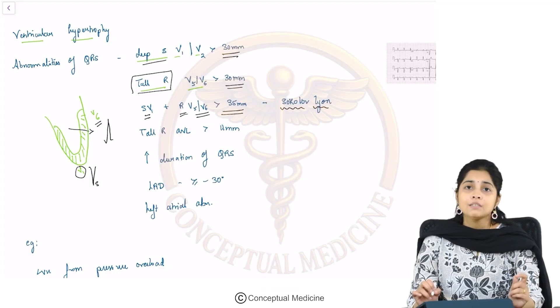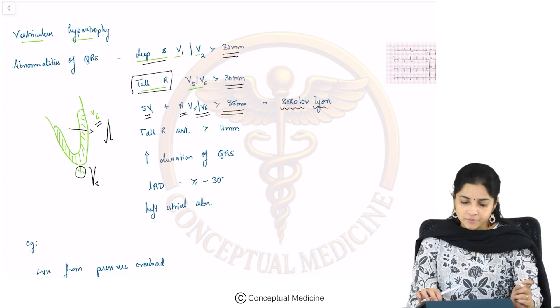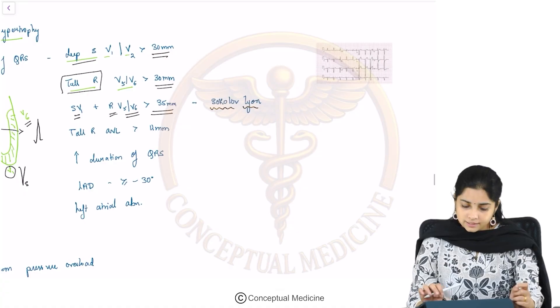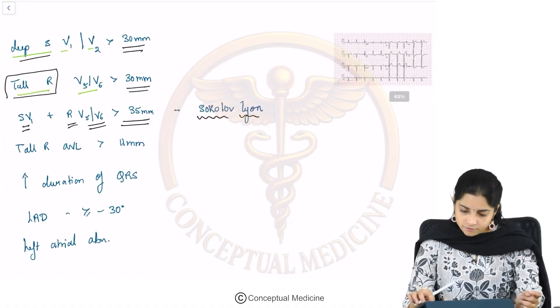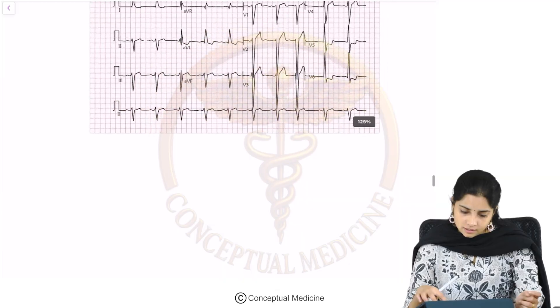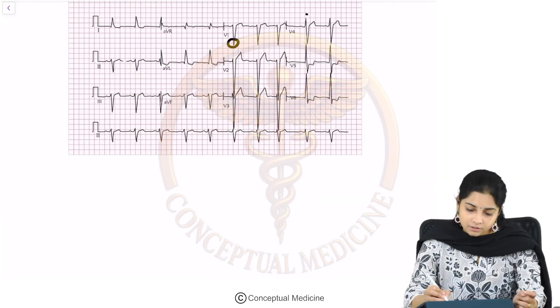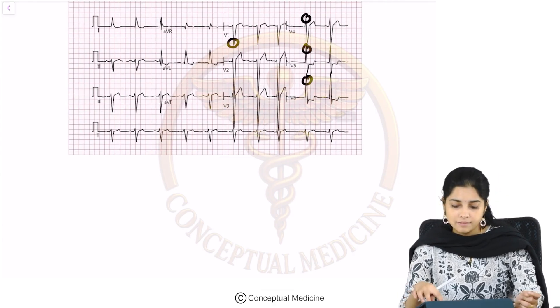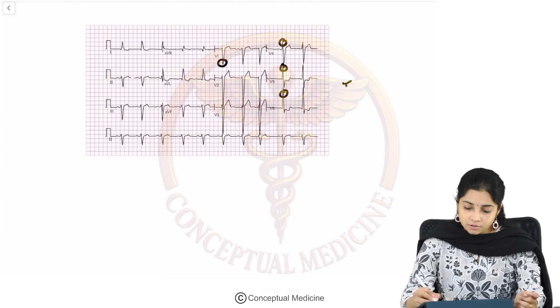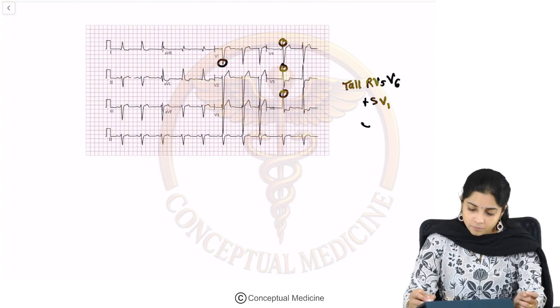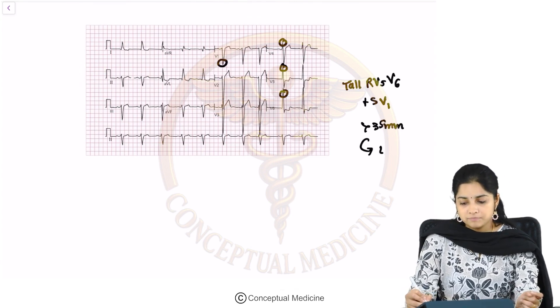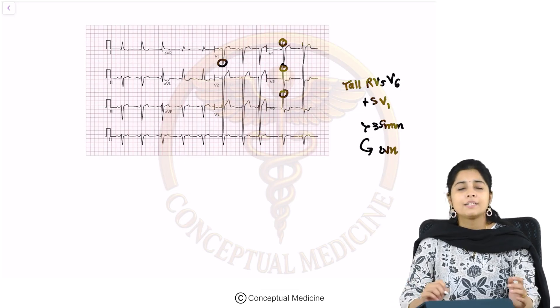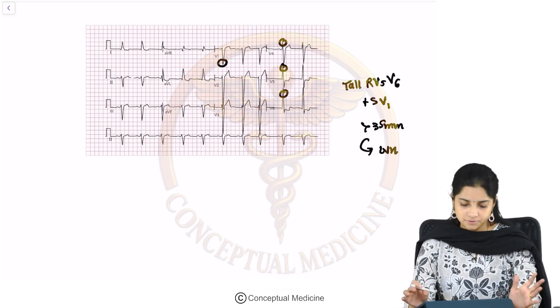Looking at this ECG, you can see deep S waves in V1 and tall R waves in V5/V6. Adding them up — tall R waves in V5/V6 plus S waves in V1 more than 35mm — is suggestive of left ventricular hypertrophy.